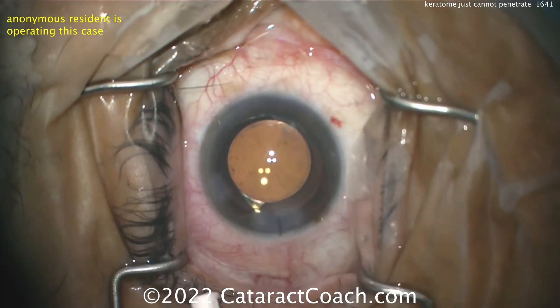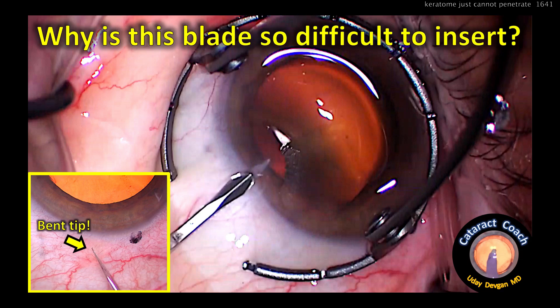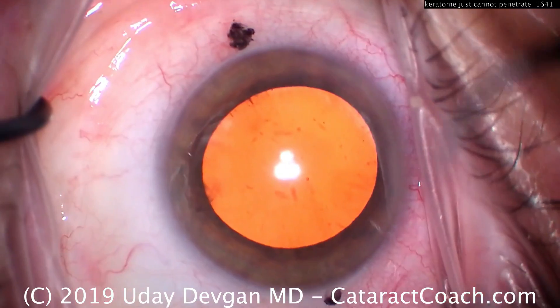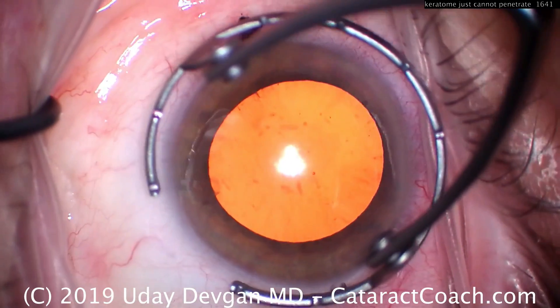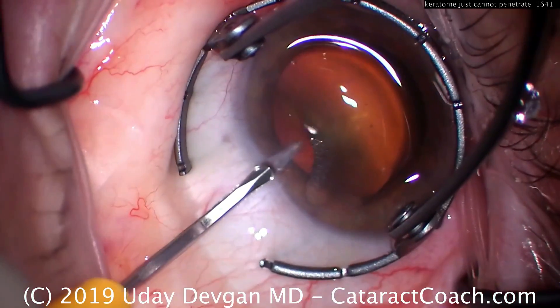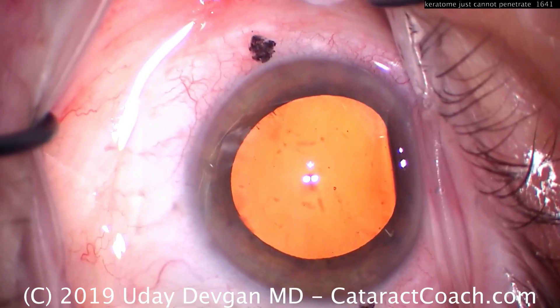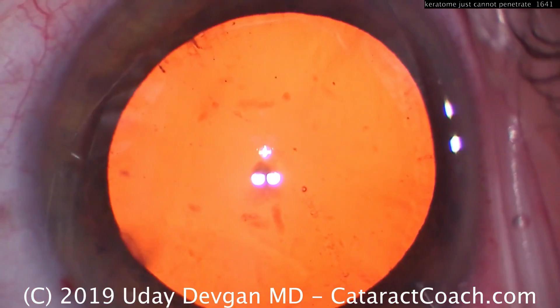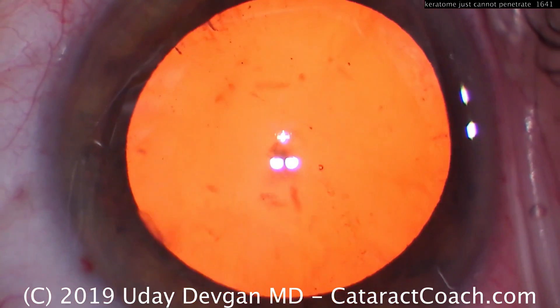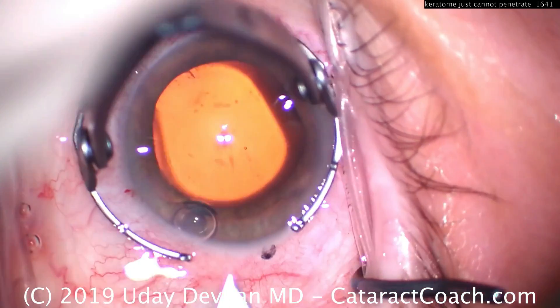Let me take you back in time to an old video here on Cataract Coach where I had the same issue. Why is this blade so difficult to insert in the eye? Because the tip is bent — look at the picture. We're making our incision with the paracentesis, and there goes the blade. It's just so dull. It finally gets in the eye. I enlarge the incision so that I won't be oar-locked. There's that tip. What happened was the technician inadvertently let the tip touch the operating room table — her Mayo stand.